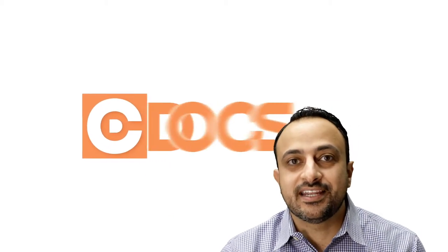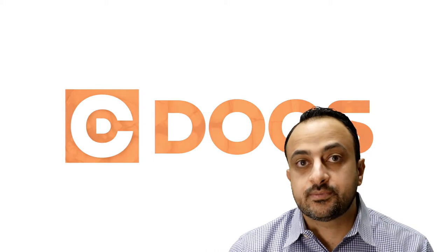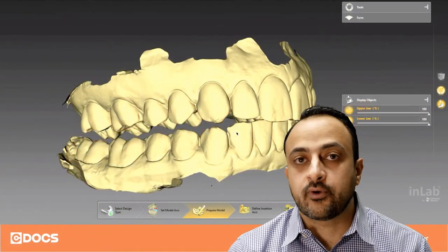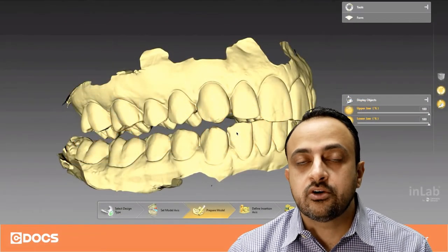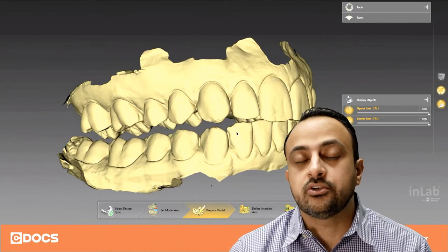This is Mina Barsoom with SeaDocs, and welcome to the tip of the day. Today I want to talk about splints, specifically how we capture bite records for our splints. One of the important features I like to do when capturing a bite is to utilize a leaf gauge.